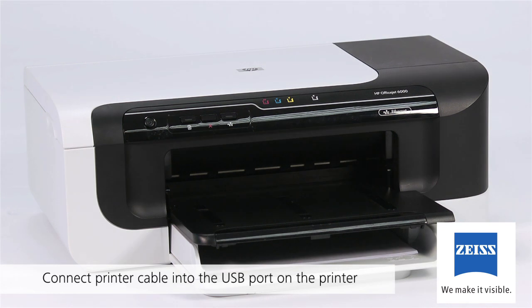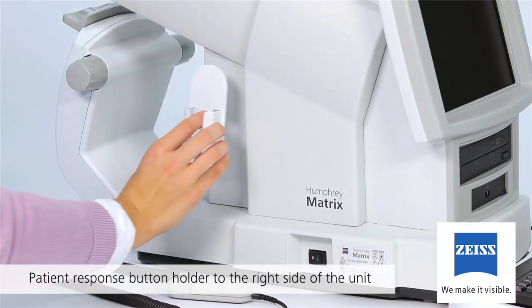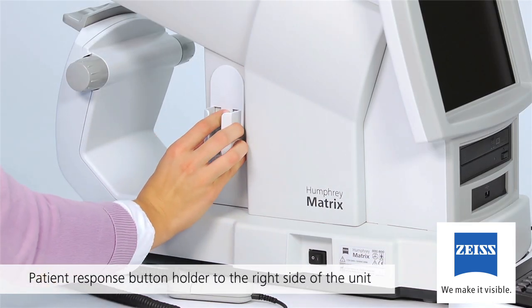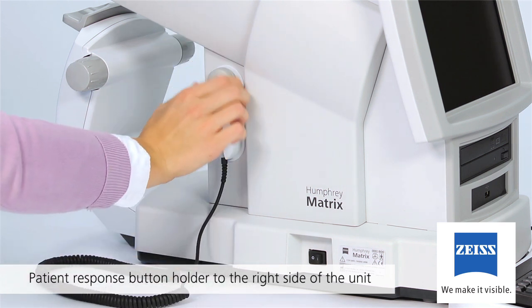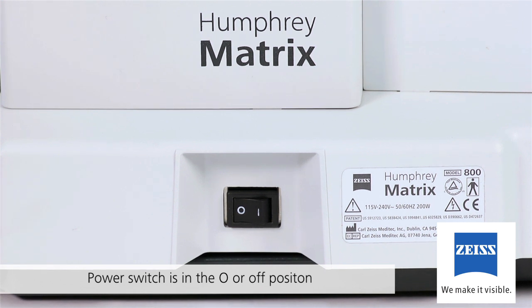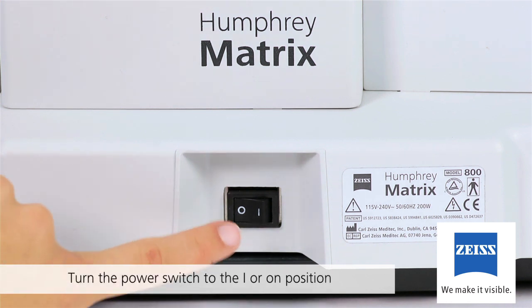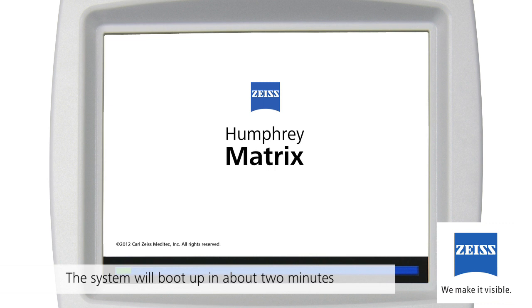Connect the printer cable into the USB port on the printer and connect the printer power cord. Affix the patient response button holder to the right patient side of the unit by peeling the tape off the holder and firmly pressing the holder in the desired position. Before plugging the unit into an appropriate power outlet, make sure the power switch on the left operator side is in the O or off position. Now plug the unit in and turn the power switch to the I or on position. The system will boot up in about two minutes.